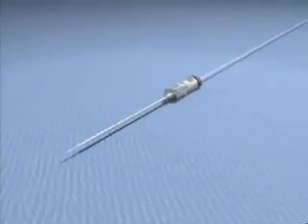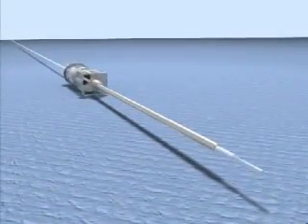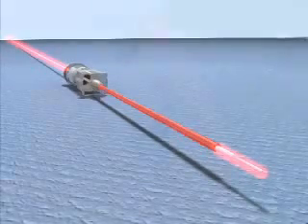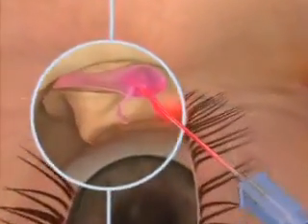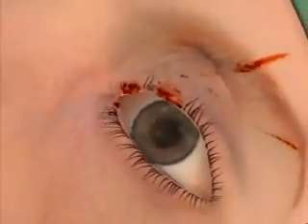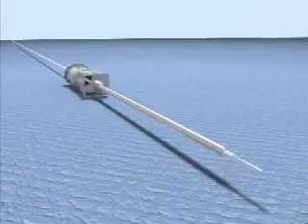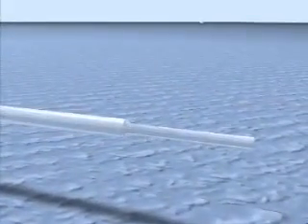To avoid complications, we do not use a metal guide wire to orient the laser fiber because of the retrograde diffusion of the thermal energy produced by this material. This overheating would cause secondary burns in the canaliculi, lacrimal puncti, and eyelids. Hence, we use only optical fiber with flexible silica or fluoropolymer cladding, shown to be resistant to high temperatures.